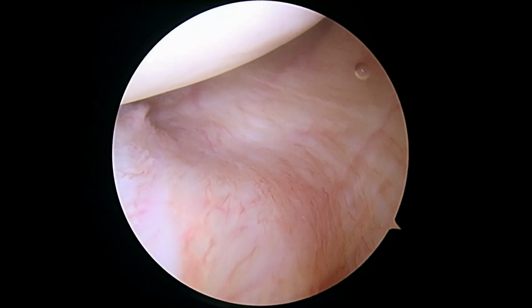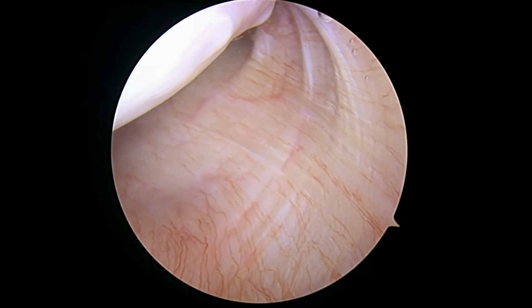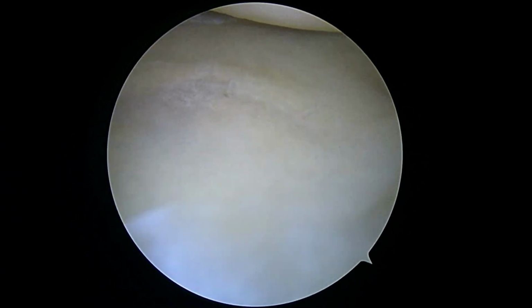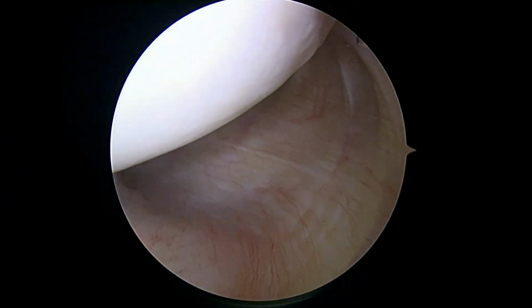Okay, so now we're looking around the back of the shoulder. This is inside the joint. This is the posterior capsule, which looks great. Happy with that. Posterior glenoid. There isn't much loss of cartilage, so that's encouraging. And it's another way of saying not much arthritis.